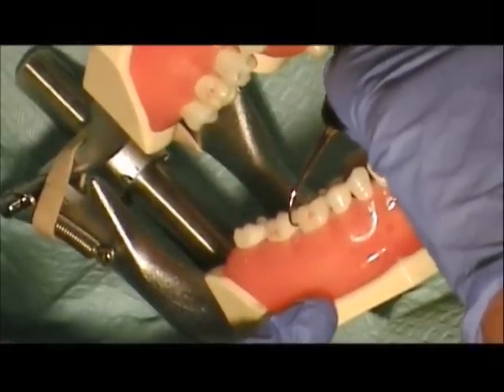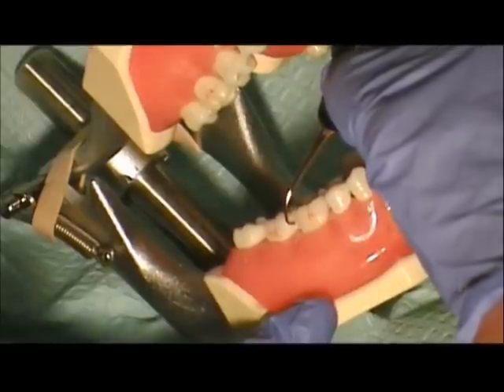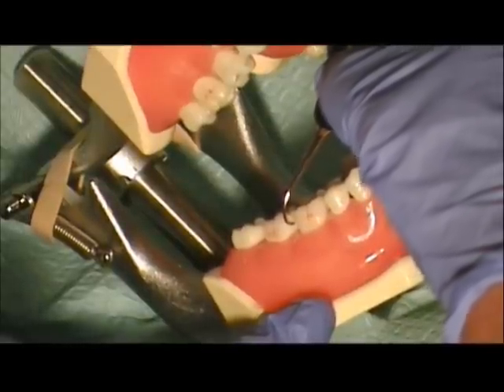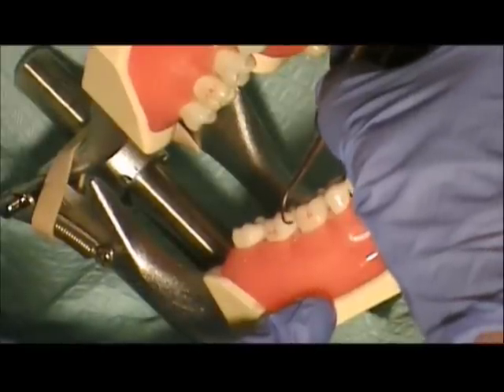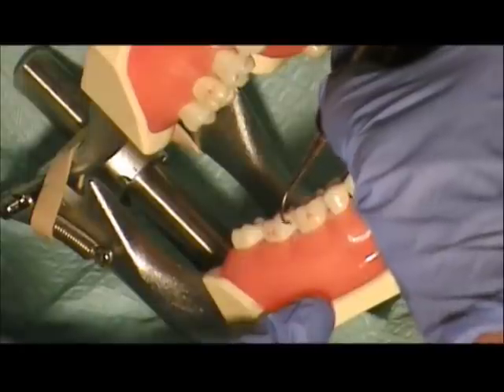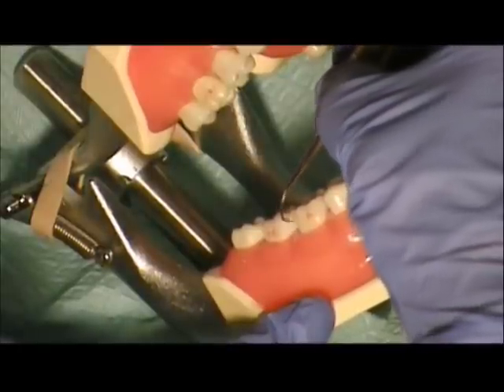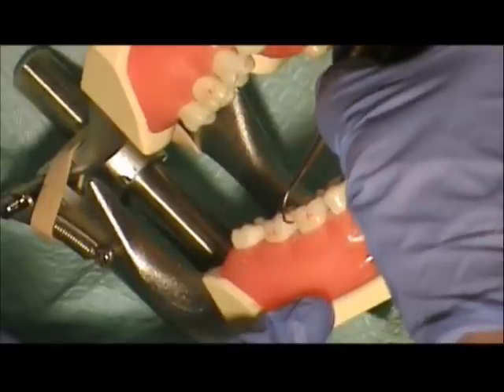Again, this is a supra instrument. We can go slightly under the gingiva to get into the proximal where we need to. Where the contact is, we want to make sure that we angle under the contact and use that nice thin tip of that posterior sickle to get where that calculus likes to be — right under that contact.